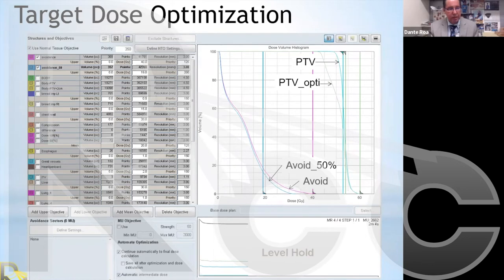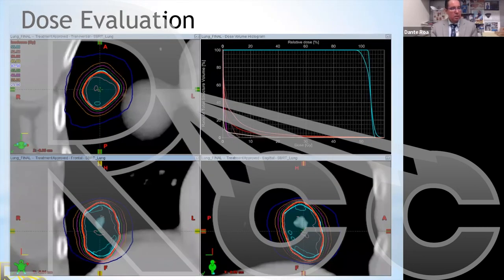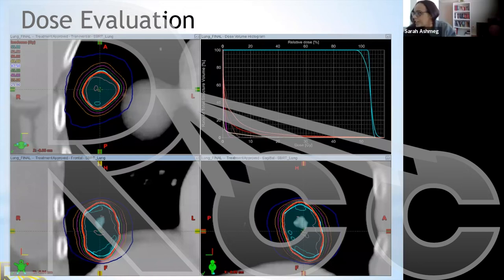Along with that, we need to keep track of the dose to all organs at risk that were contoured — the rest of the lungs, the esophagus, and so on — all of which have to be minimized according to the dose tolerances indicated in the RTOG table.